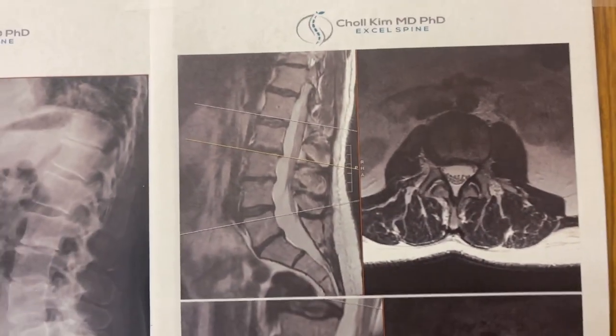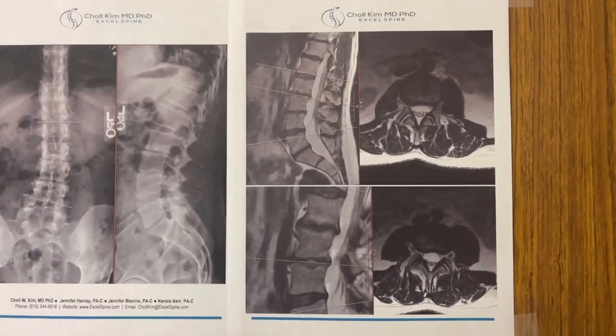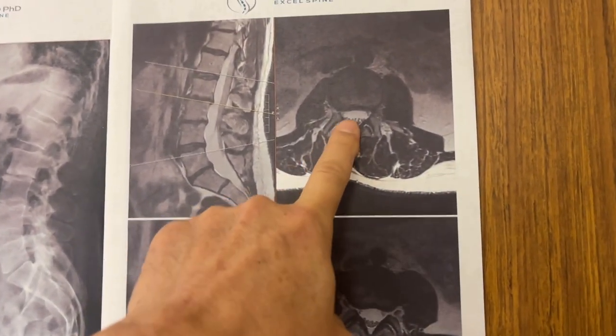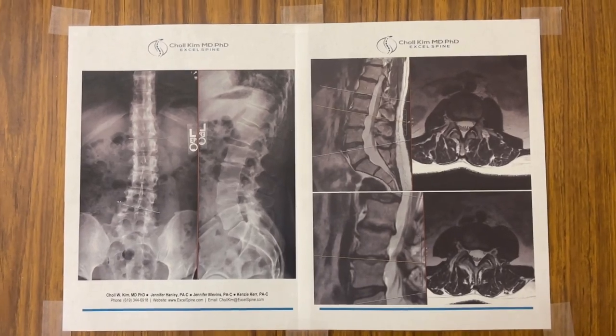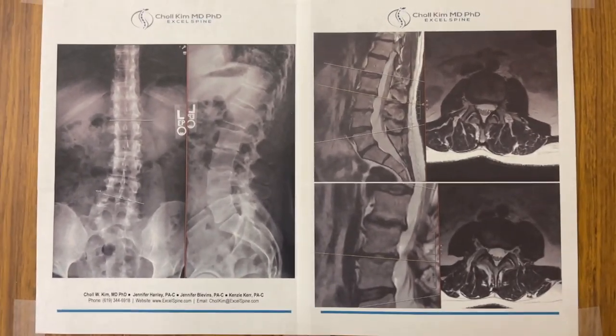After much ado, we've decided to proceed with an endoscopic surgery where we can go in here, reinitiate a healing response, make sure the nerve is free, and find any entrapped nuclear fragments within an annular tear. I anticipate that he'll get a very good result with a tiny little bandaid afterwards, and hopefully he'll avoid a big surgery like a fusion. So we're all hoping for the best.